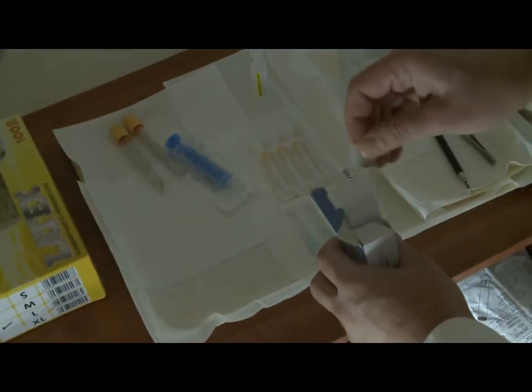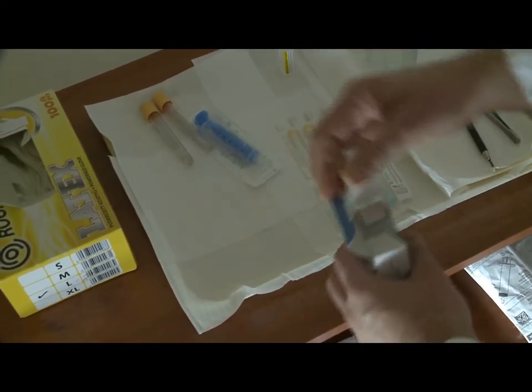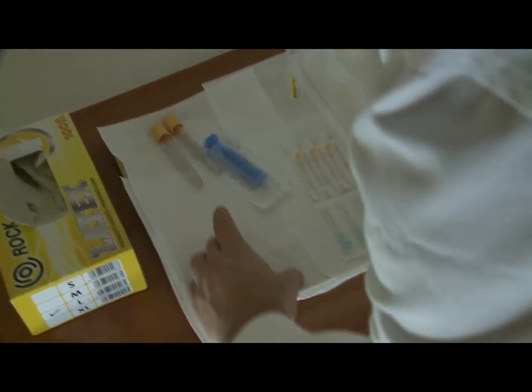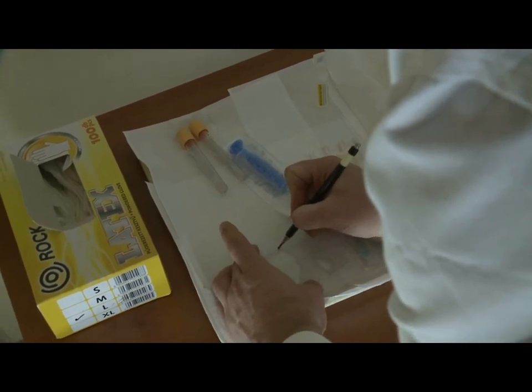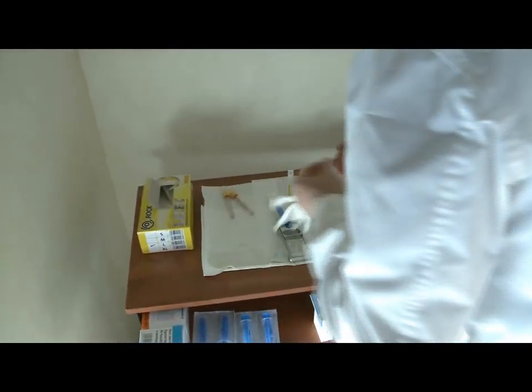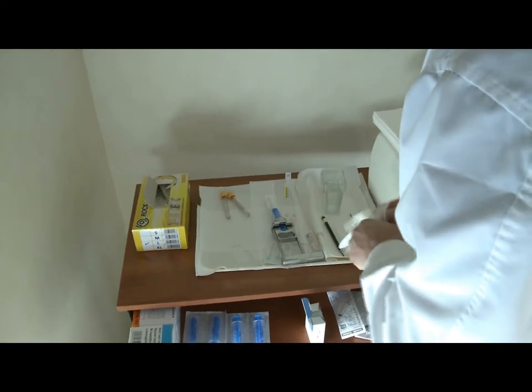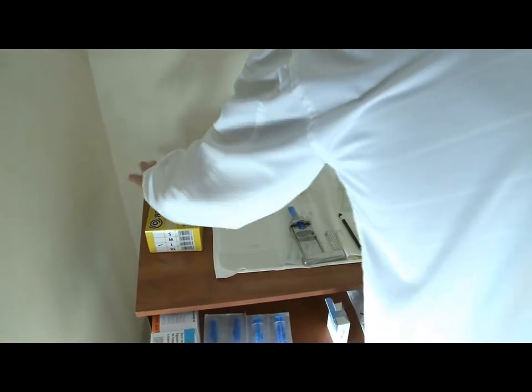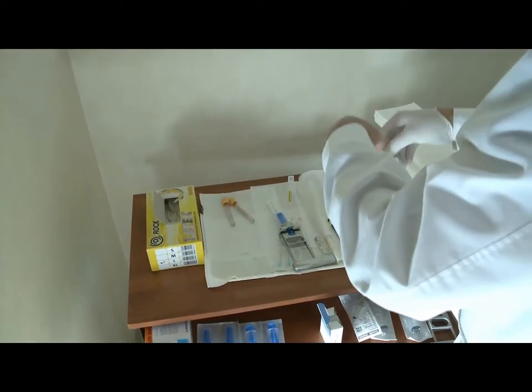The first and very important rule is the signing of the slide. For safety, I suggest that this be done by the person who is also sampling. I don't think that ultrasound guided aspiration requires the involvement of another person — this is a one-man show or a one-woman show.